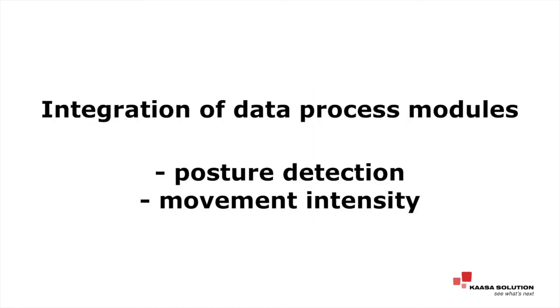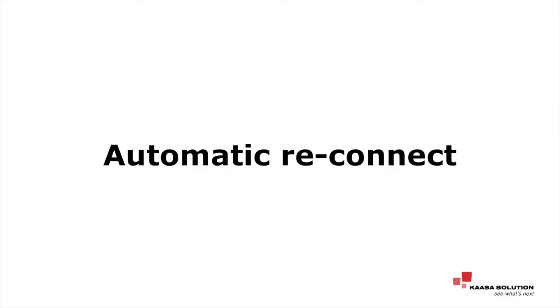One more feature that we have is the integration of data process modules, which means we have pre-processed algorithms that do posture detection or movement intensity implemented there. And then another feature within the LT is automatic reconnect. So if there's no connection, the sensor comes back, all is running smoothly after that.